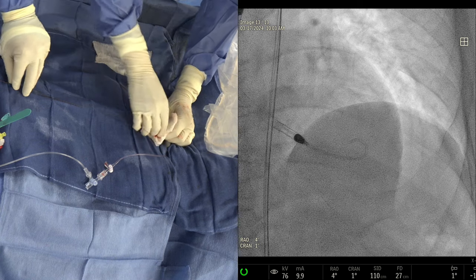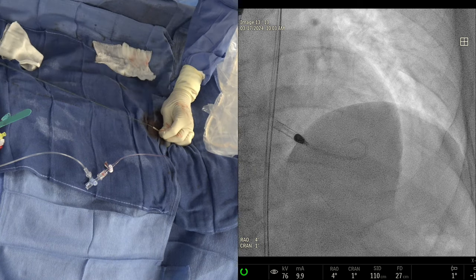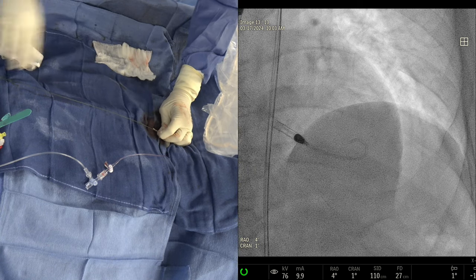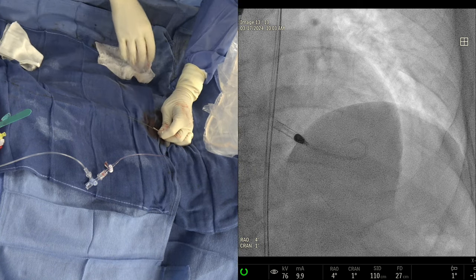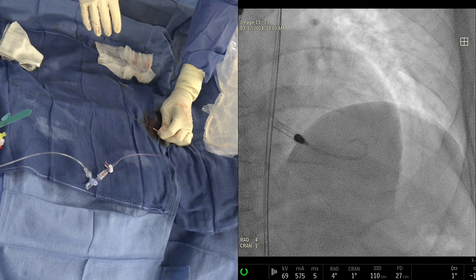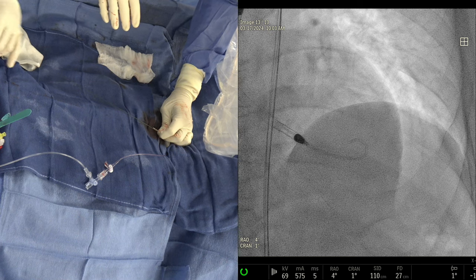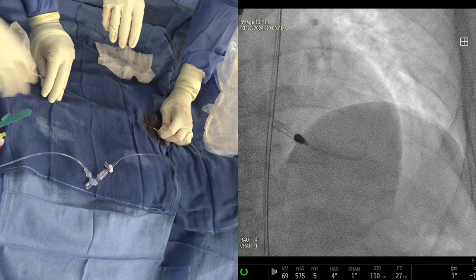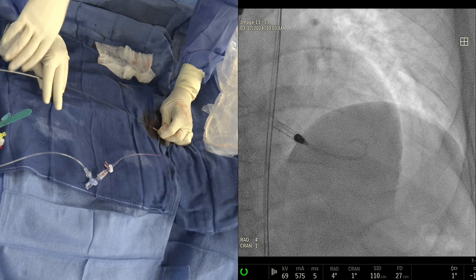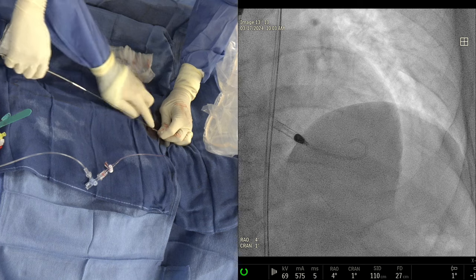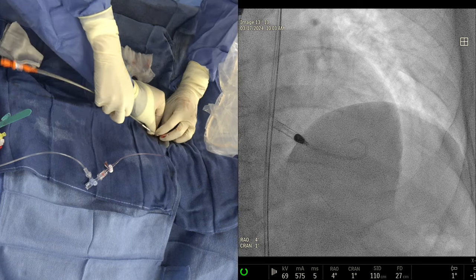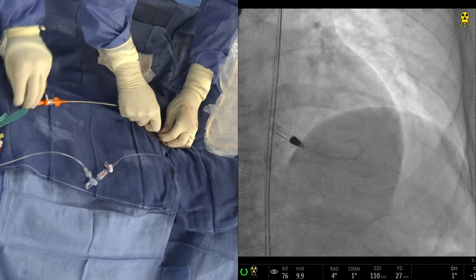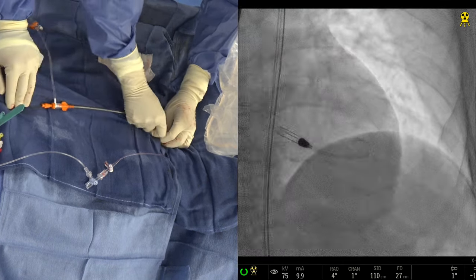This will be our third case with it, and it definitely makes things a little more slippery — it's better compared to what we've been using before. The 035 wire has been advanced. Dr. Stone has joined and asked if this was a PROTECT 4 case. Every case being moderated lately has an EF of 31 or 32 percent.